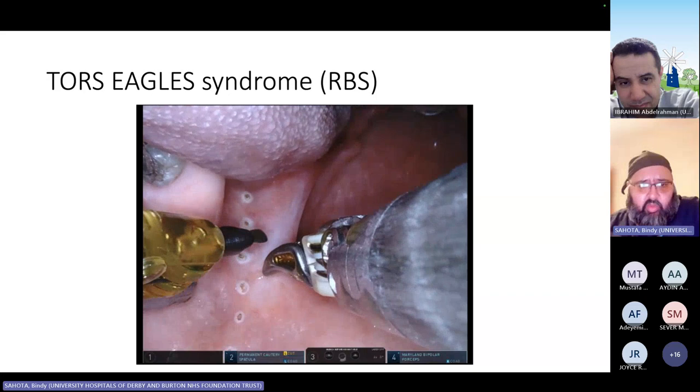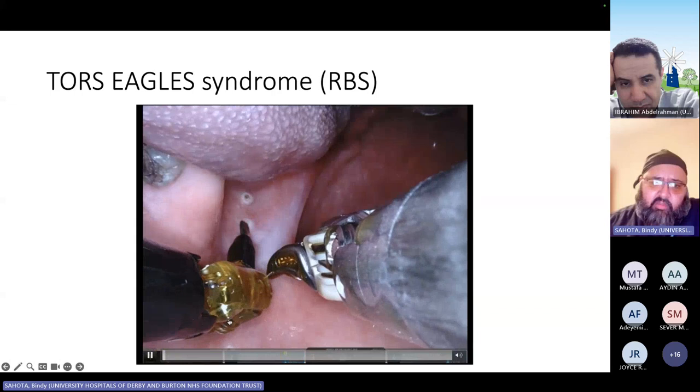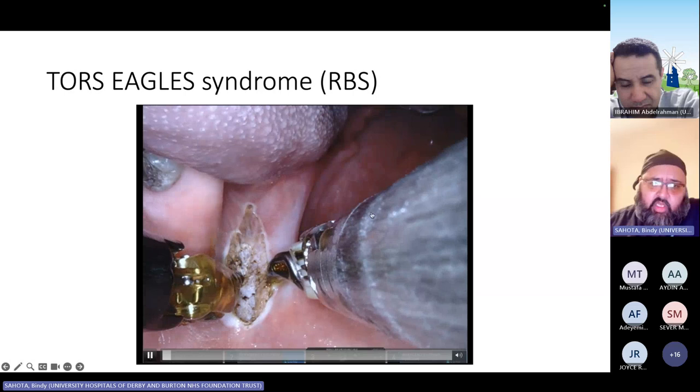So you open the pterygomandibular raphe. You can see here is the mandible. Here you can see the anterior tonsil pillar. I often feel for that crease and just come straight down in that zone there. I open that pocket, so the tonsil goes medially. I'd keep the tonsil in.